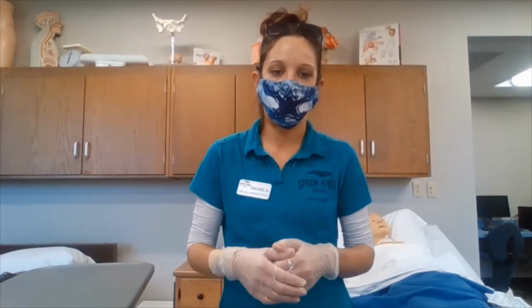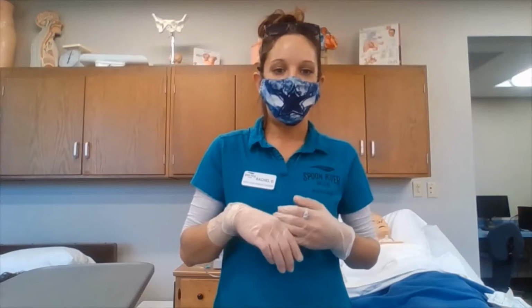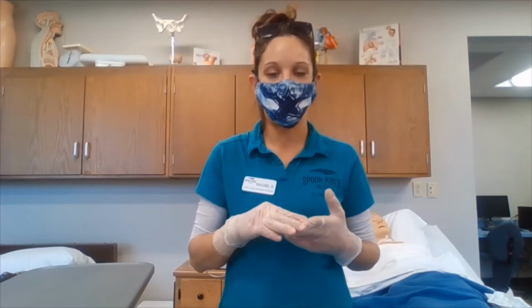Before starting this procedure, we are going to be making sure that our patient is properly positioned. Normal positioning for this procedure is high Fowler's position. If a person is comatose, then we are going to have them in semi-Fowler's, and we are going to ask a coworker to help position the patient's head during the procedure. If they are combative, we are also going to ask for assistance from another coworker.